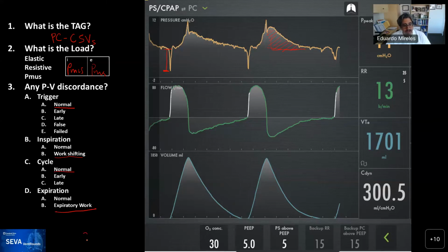So under this mode, my goal is comfort, and we are better, at least visually, because I know exactly what the patient is doing compared to before, than on pressure control. You could say, well, you didn't change much. The patient is still doing whatever he wants, but at least now I know the truth, rather than before when I was seeing extra layers there. That's my thoughts. A really great analysis. Thank you. Okay.